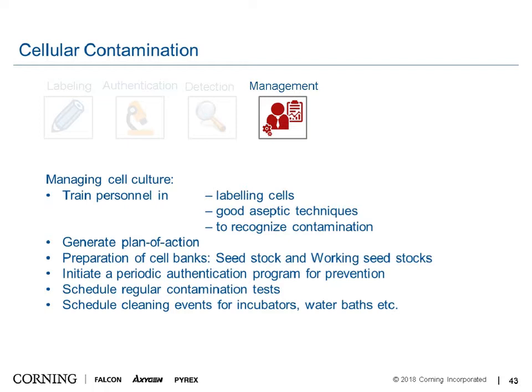A periodic authentication program is very helpful — detecting contamination early saves a lot of problems when publishing, where you might otherwise discover that experiments were done with, for example, lung cells instead of gut cells. Regular contamination tests should be performed at minimum for mycoplasma, since it is not visible and can have a big impact on results and cell behavior. Cleaning events should also be scheduled for incubators, water baths, and biosafety hoods.